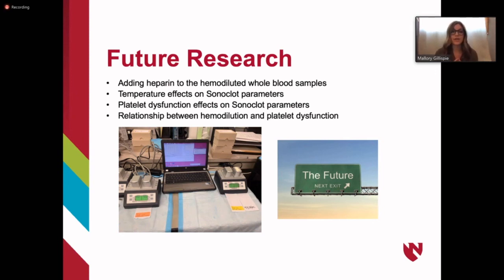And then another avenue we would like to go down is platelet dysfunction effects. All of our patients were above the age of 18, healthy, no cardiovascular comorbidities, none of them were on platelet impacting medications. So presumably, all in all, healthy platelets. So since we saw this consistent effect of dilution on platelet function, it'd be interesting to see how even minor platelet dysfunction or severe platelet dysfunction would impact this parameter. And as we know, on bypass, we are going to induce platelet dysfunction simply from contact activation alone.